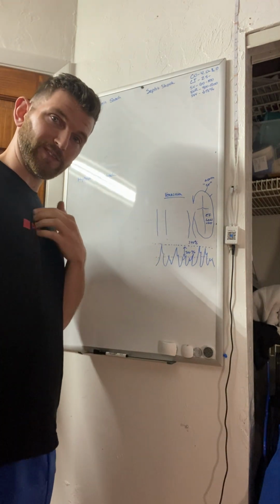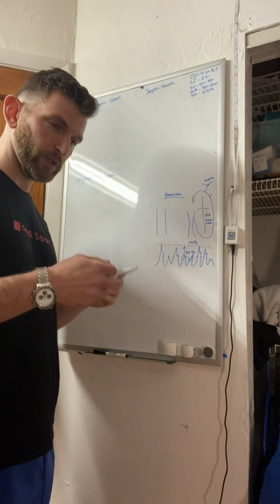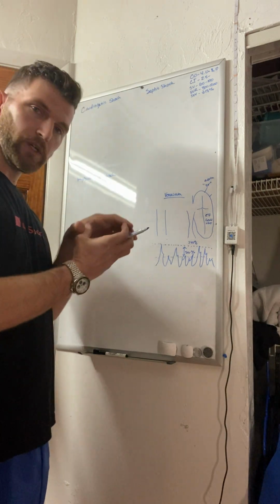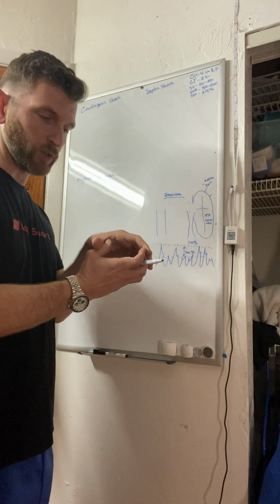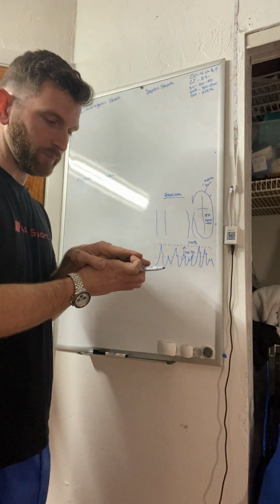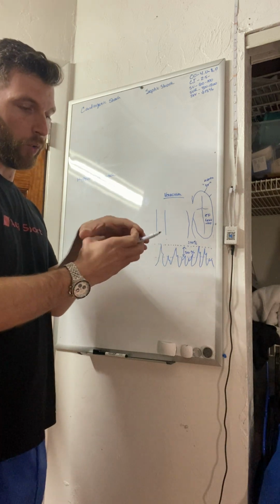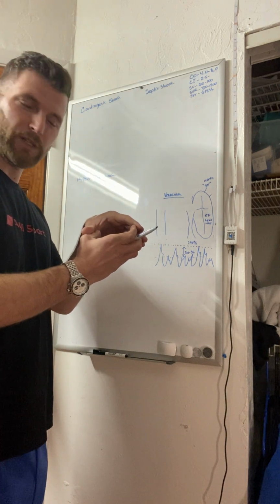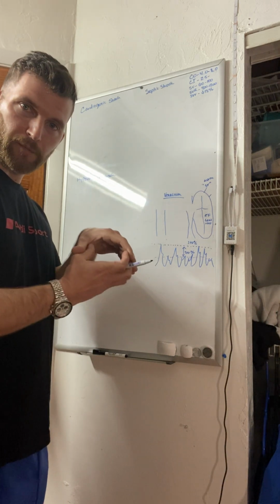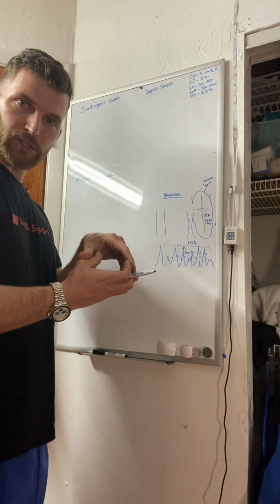The vena cava is inside the chest cavity, and as you take a breath in and a breath out, you get an increase and a decrease in pressure, right? That increase and decrease in pressure has an effect on the circumferential pressure of the vena cava. It's either going to collapse the vena cava if it is empty or has less fluid in the venous system, or the vena cava is going to just go a little bit, but for the most part stay pretty plump, right? So with a breath in and a nice plump vena cava with good volume in the body, you're going to see very minimal collapsation of that, right?